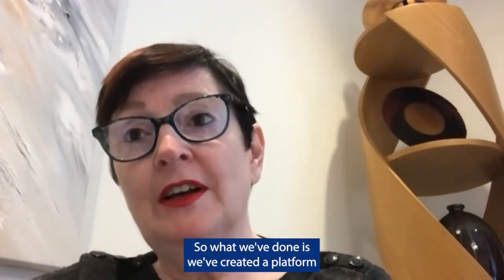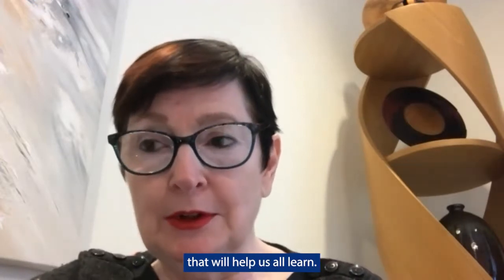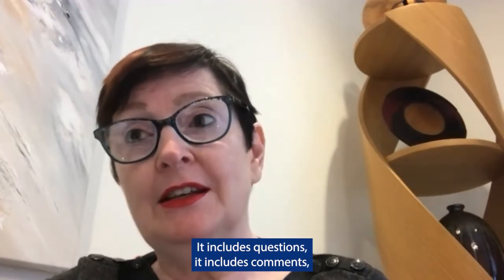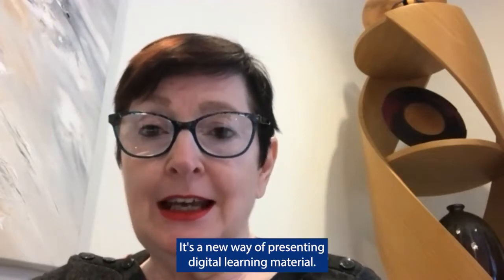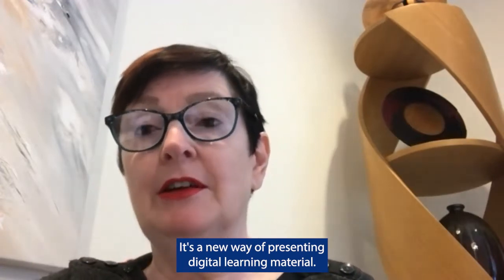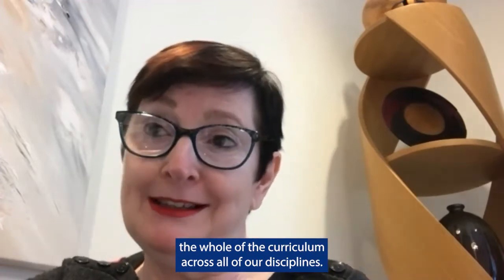What we've done is create a platform with trainees and with colleagues that will help us all learn. It includes questions, comments, and context for particular cases. It's a new way of presenting digital learning material, and will eventually build up to cover the whole curriculum across all of our disciplines.